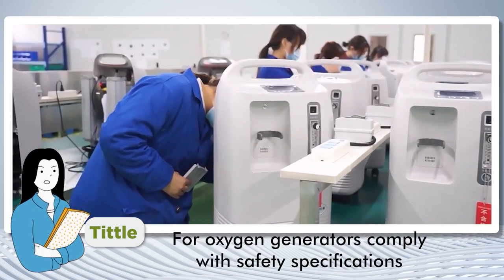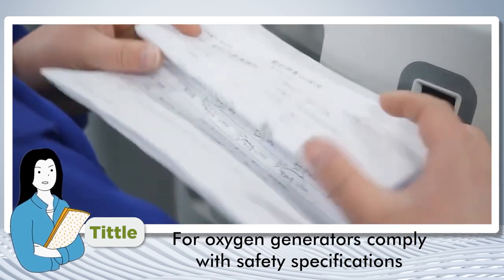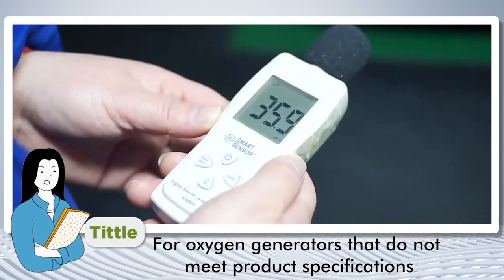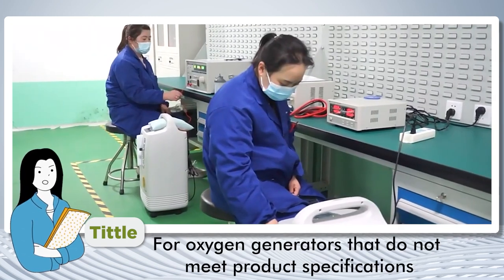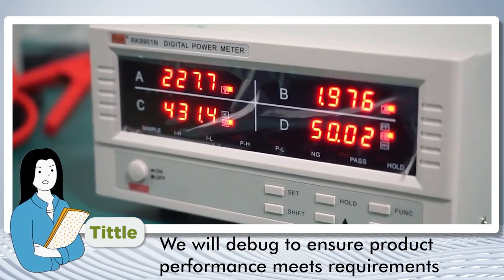Subsequently, in order to make oxygen generators comply with safety specifications, we also check for noise and safety. For oxygen generators that don't meet product specifications, we will debug to ensure product performance meets requirements.